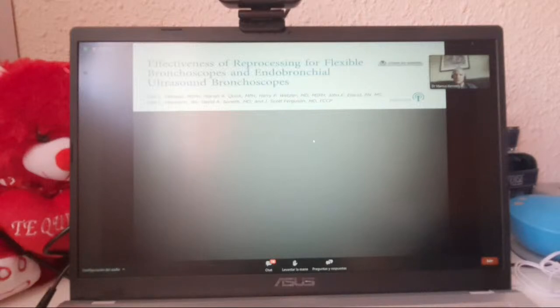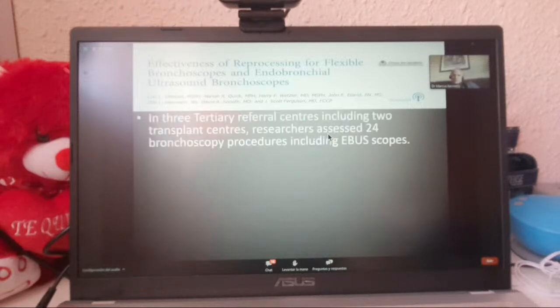This was a very important seminal paper published in the last 3 or 4 years. It looked at the effectiveness of cleaning bronchoscopes and ultrasound scopes, and it was done in 3 tertiary referral centers in New York City.